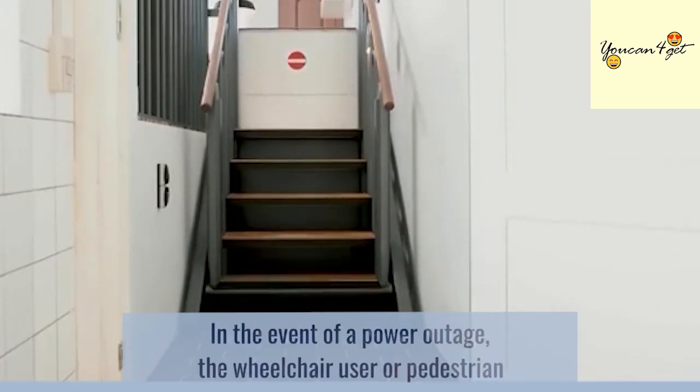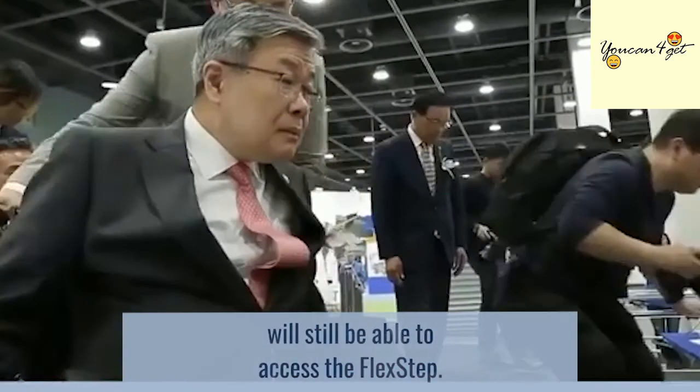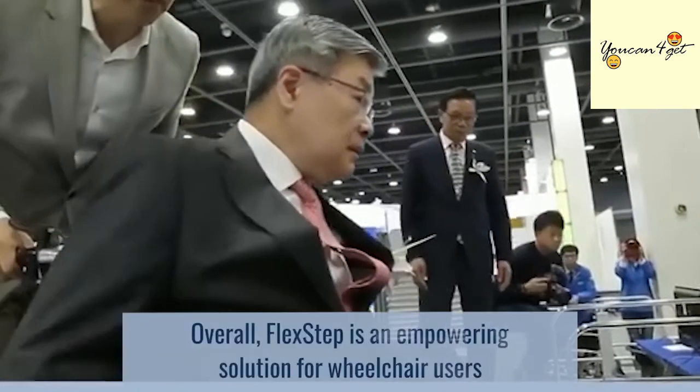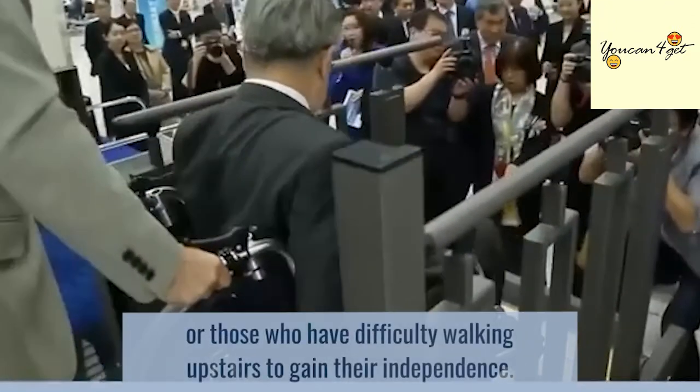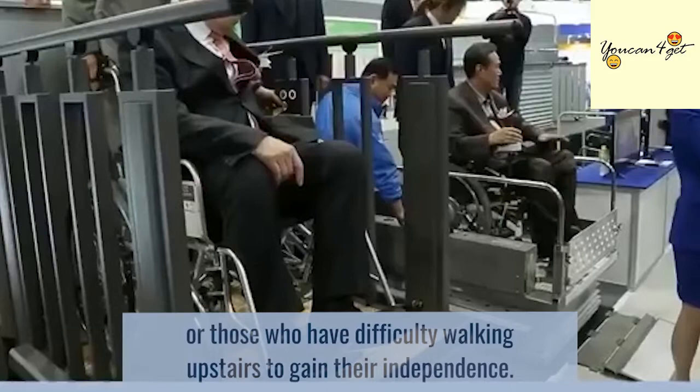In the event of a power outage, the wheelchair user or pedestrian will still be able to access the FlexStep. Overall, FlexStep is an empowering solution for wheelchair users or those who have difficulty walking upstairs to gain their independence.